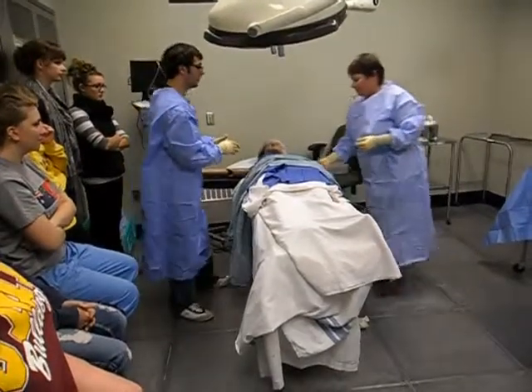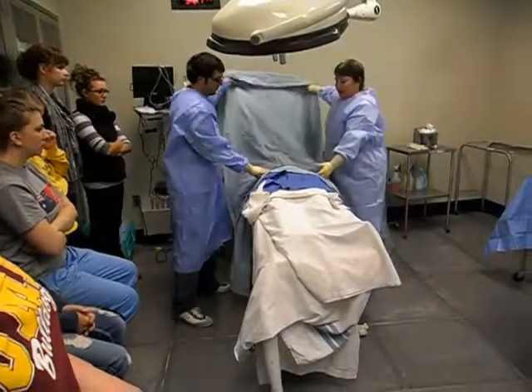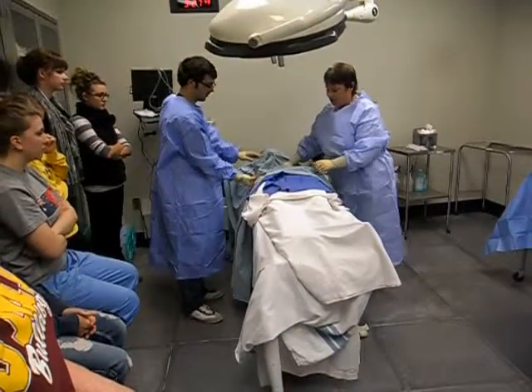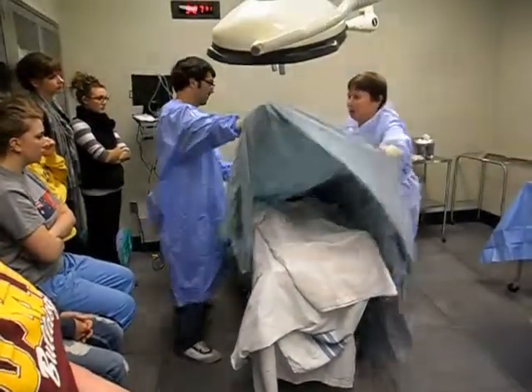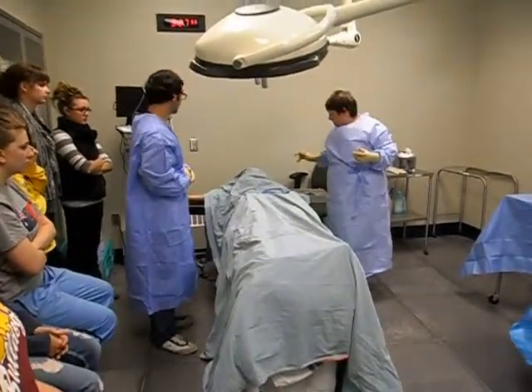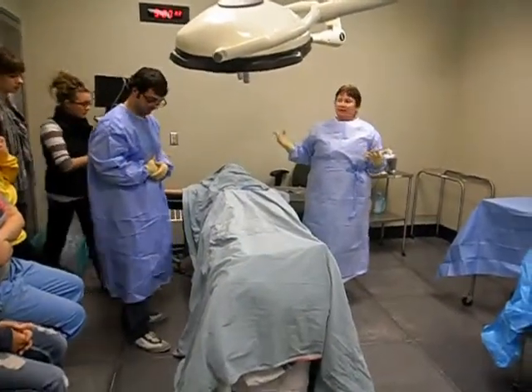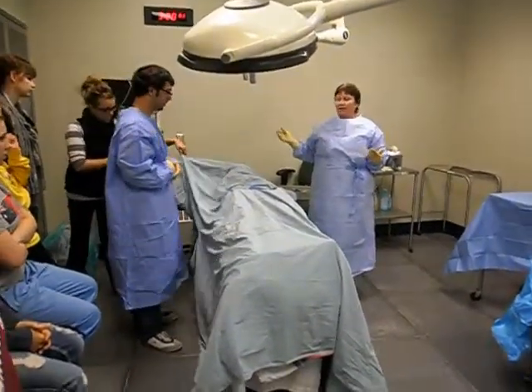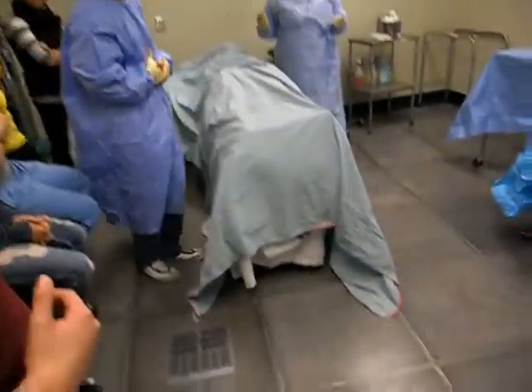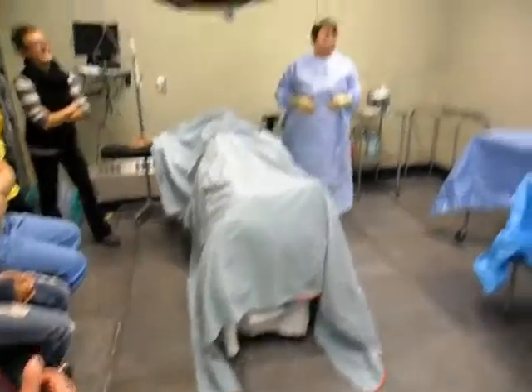Okay, we got it wrong, but that's all right. And that might happen. Once it's put on wrong, there's nothing you can do. You just can either work with it or you have to take the whole thing off. Now, the problem with it being wrong is we don't have an arm thing on that side now. That's okay, we're just gonna have to get another sheet or whatever. We would not get another drape if we didn't have to. Oh, you can use that stockinette you had.